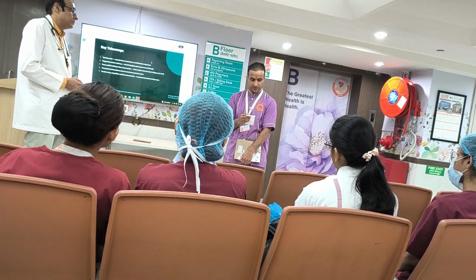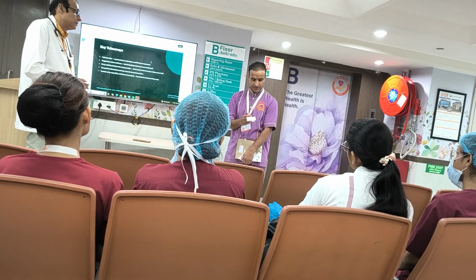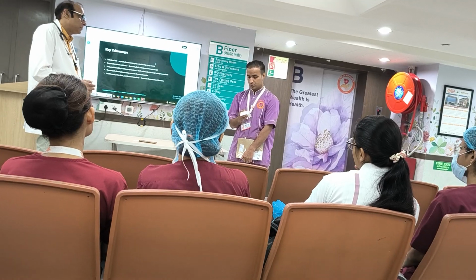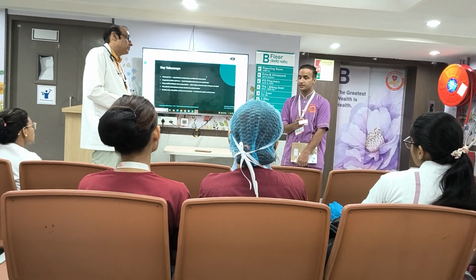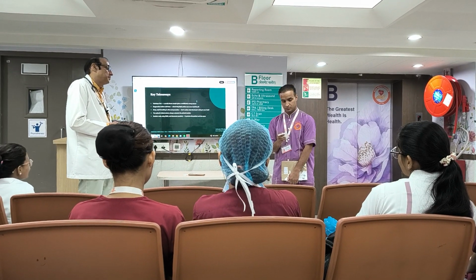Model JAM 3500. pH level is 7.47. Is it normal or abnormal? Sir, it is abnormal. It is higher, so alkalosis. Okay, fine.